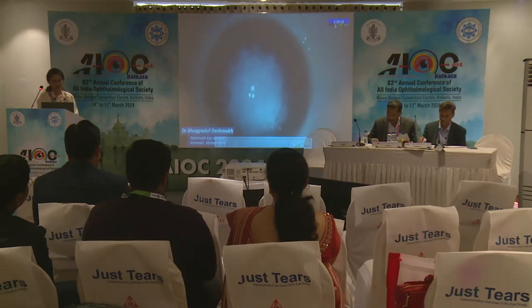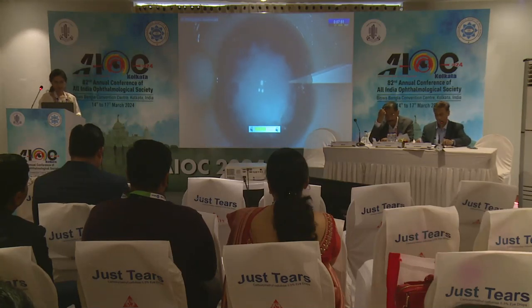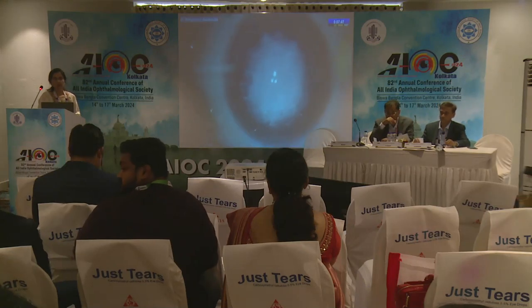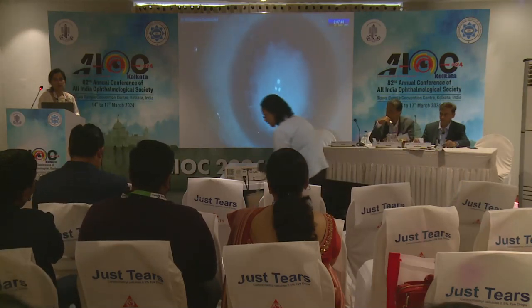Hello friends, this is a case of a 5-year-old boy with developmental cataract. But there is something unusual. It is partially absorbed. And as I noticed, there is wrinkling on the anterior capsule with a fibrous membrane beneath it.